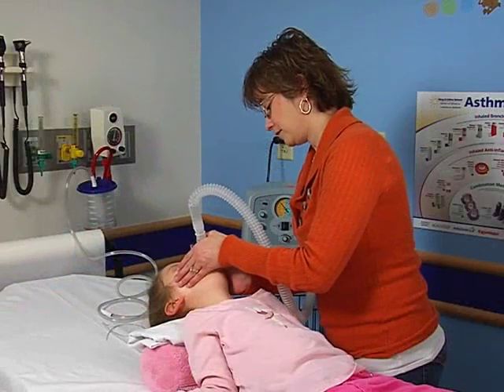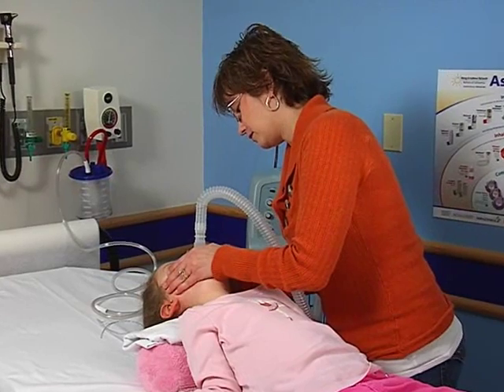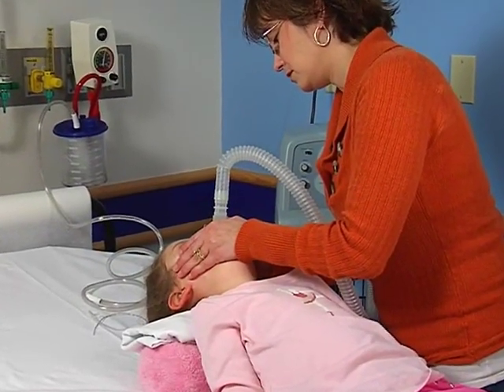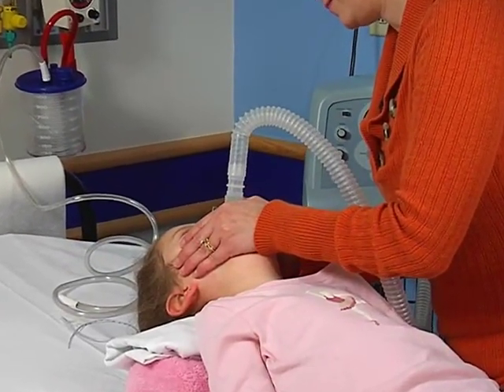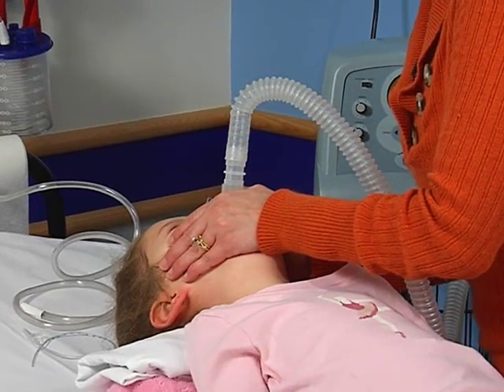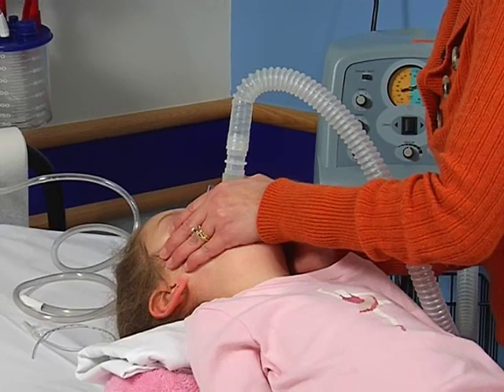As you get used to the pressures during inspiration and expiration, you will want to increase the pressure to the maximum amount that you can tolerate. Once you get to the highest amount of pressure that you can tolerate on inspiration and expiration, you will no longer have to adjust the pressure. If you need to lower the pressure at any time, you should notify your doctor.